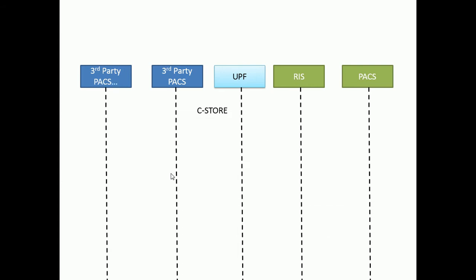Another example, if you can't do an HL7 interface, which is common, there's certainly many customers who can't do an HL7 interface. So in those scenarios, we'll get a CStore, and this is just one option. We could do a CStore, so we get an image or a study from a PACS system or from an archive, and rather than using HL7, that would be our trigger. A DICOM header usually has the same information that we would find in an HL7 ORM message. Not as structured, it might not be as good, but it's enough for us to trigger an Ultra Prefetch job.